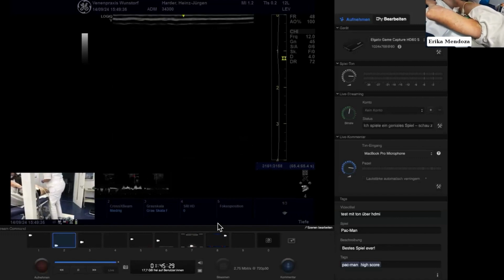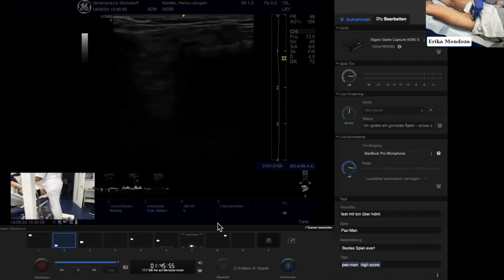I'm very happy with this case because a lot of the candidates are vascular surgeons. So this definitely shows the way massive varicose veins can be treated with endoluminal technique. Yes. As you see here, we still see a vein with the eye. And I will go here inside and I will give a further dose. I think I will have extra vasated.